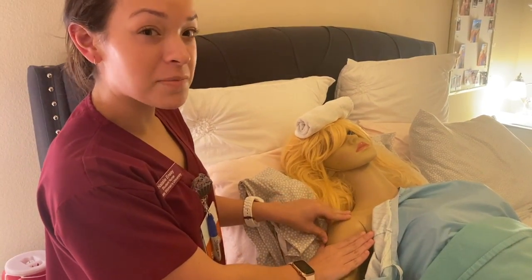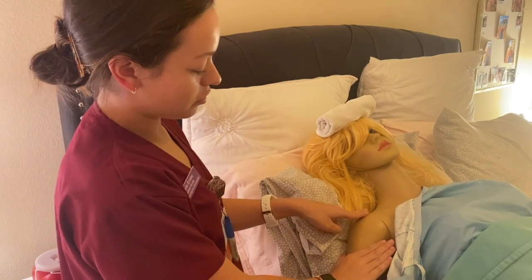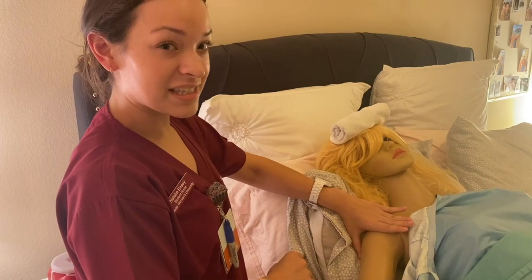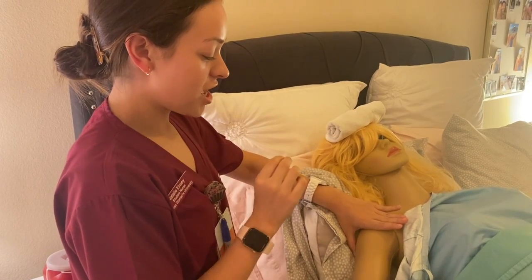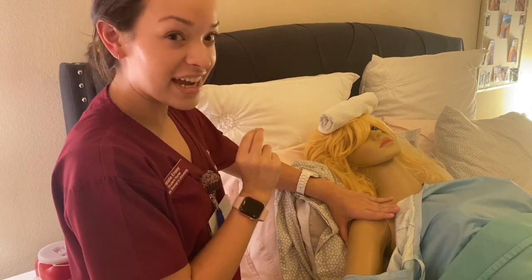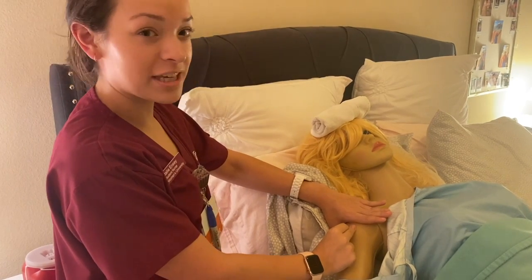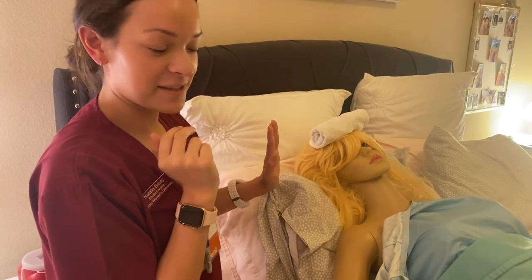And for my Z-track method, I'm gonna demonstrate it on the deltoid site. I would find my site, so 2 to 3 finger breaths, 1, 2. So I'm gonna keep it like that, the triangle. And I'm going to use my left hand to keep the site taut, keep the skin taut. And I'm going to use my dominant hand to inject the injection. And I'm gonna have it like a dart and go very fast and direct. And I would put it in at the site and keep it in for 10 seconds. I will inject it first and keep it in for 10 seconds while keeping the skin taut. And once I inject it, I'm going to take it out and release.